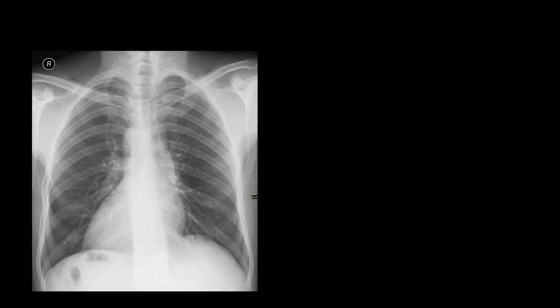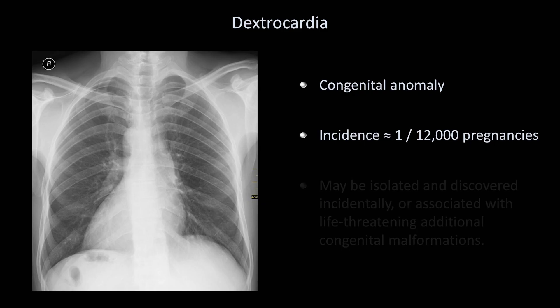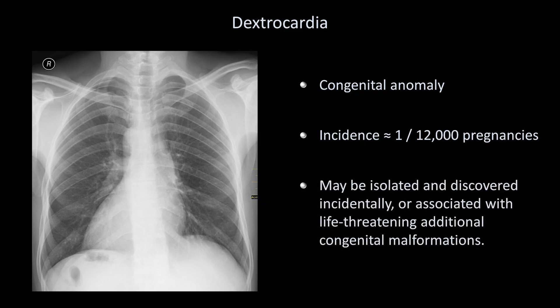Before moving on to the mediastinum and hila, I want to briefly mention a congenital anomaly which, although relatively rare, tends to be mentioned during rounds or on tests out of proportion to its prevalence. At first, you might assume this x-ray was loaded backwards, if it weren't for the capital R in the upper corner indicating the correct orientation. This person has dextrocardia, which occurs when the heart loops in the opposite direction as normal during early embryologic development. Its incidence is about 1 in 12,000 pregnancies. It may be isolated and discovered incidentally, or it can be associated with life-threatening additional congenital malformations.